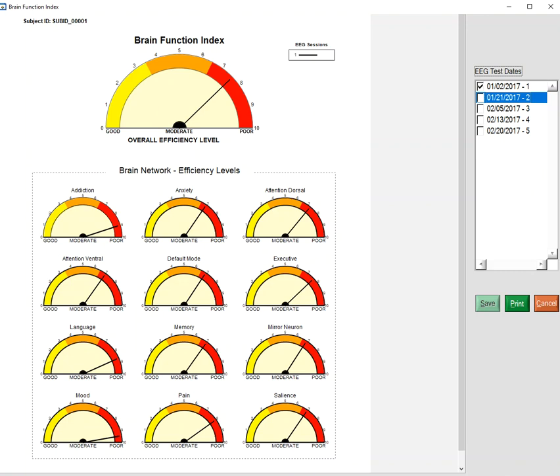This is a video of the Brain Function Index, a new product inside of NeuroGuide. One activates it by first importing an EEG in an eyes closed condition, editing that EEG so there's no artifact, then clicking Analysis, Brain Function Index, and this type of display will be produced.